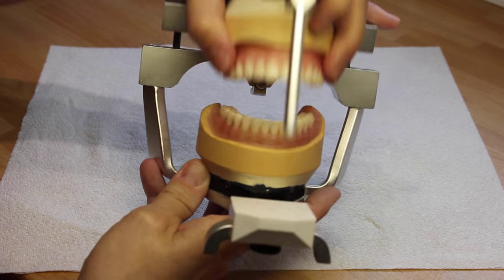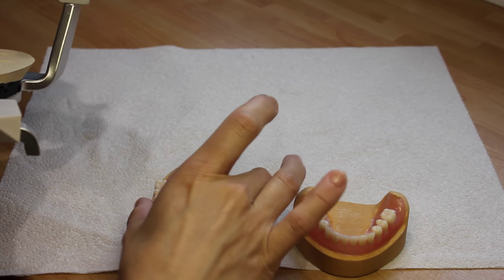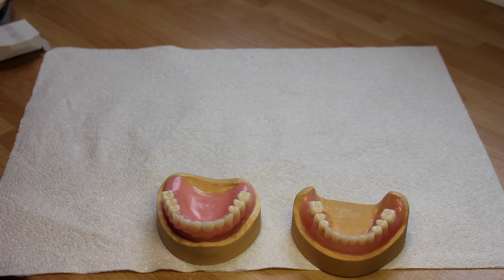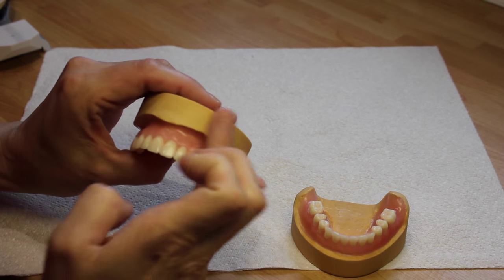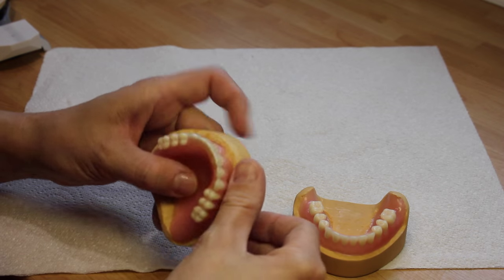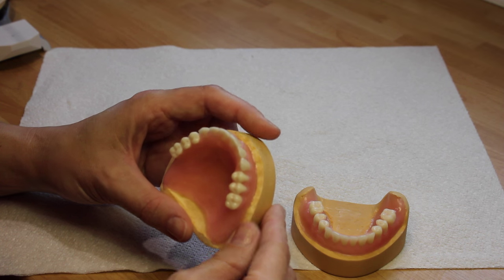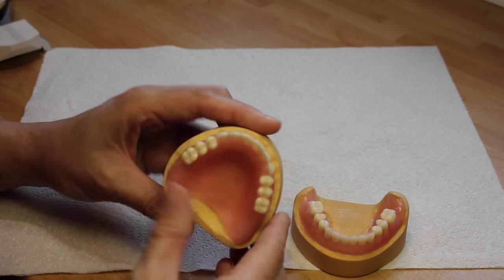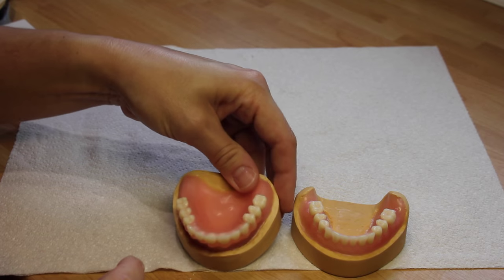In this case I'm processing on the master models so I've split mounted them. It's very important that your models are trimmed to be 90 degrees to the base and have a fairly wide land area, at least three to four millimeters, ideally five millimeters. The dentures also need to be sealed down around the periphery, exactly the same as traditional flasking.